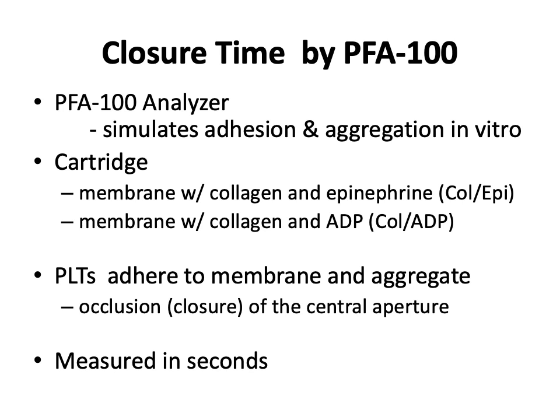The PFA-100, or Platelet Function Analyzer 100, is an instrument that simulates platelet adhesion and aggregation. The instrument requires a cartridge that contains a membrane with collagen and epinephrine and another with collagen and ADP.